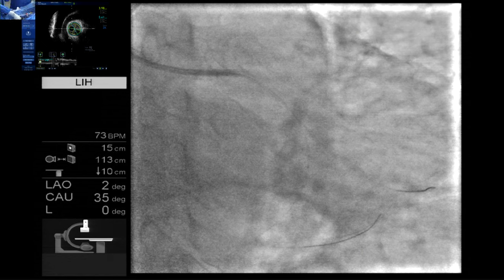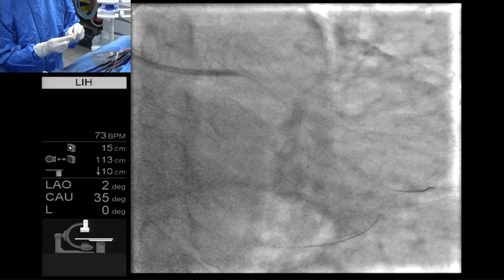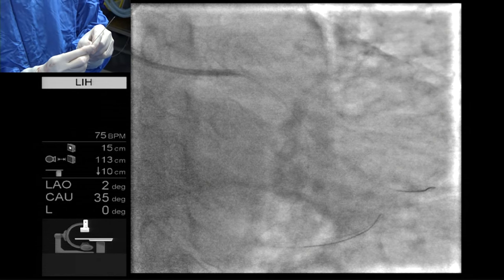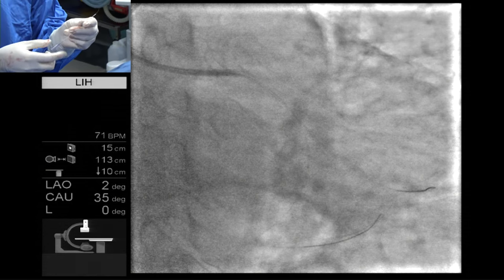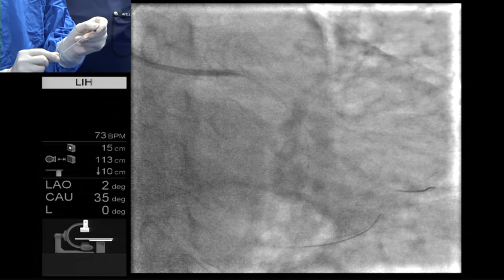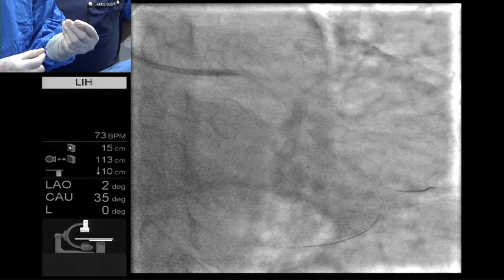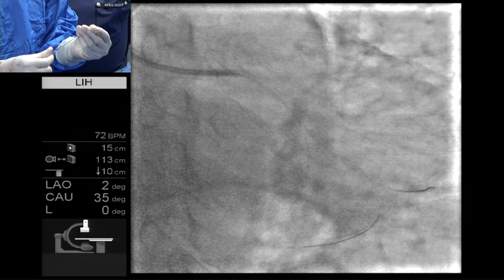Tak, as you're getting prepared to do that, can you give us some tips on positioning the main branch NC balloon in terms of the timing of when you remove the balloon from the OM? One of the dangers is if you've put it there so precisely, if it gets pulled back when you're pulling out the balloon from the OM, you may not be able to cross again. So do you err on putting that crushing balloon more distal and then position it? Correct. Yeah, that's the point before I inflate the side branch stent.